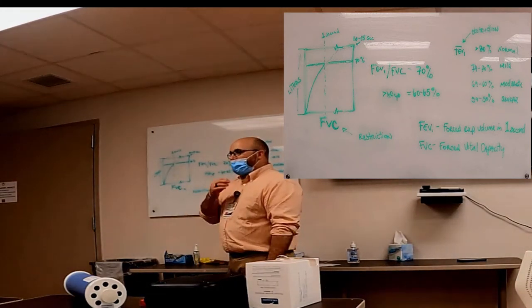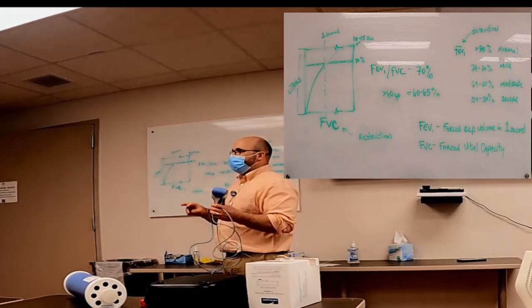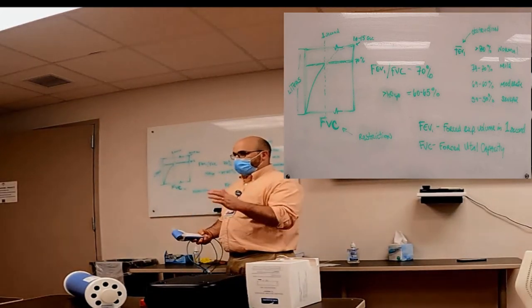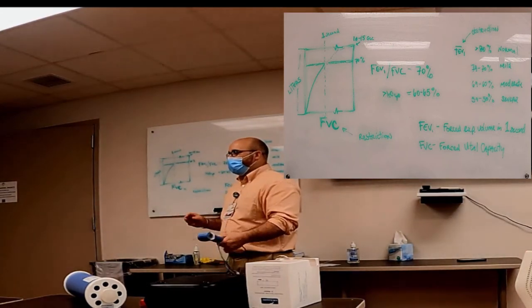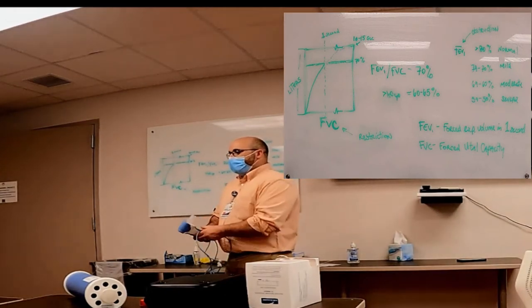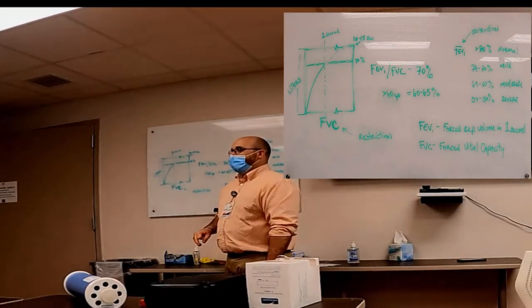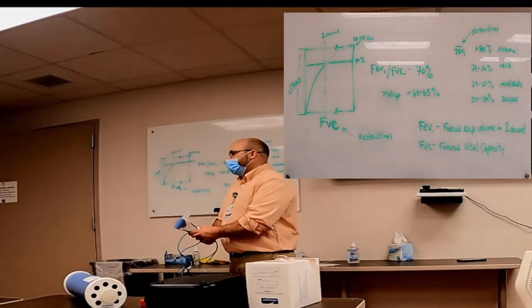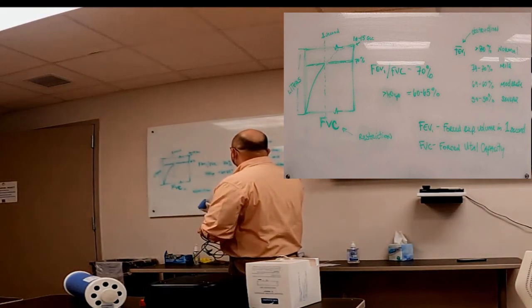That makes more sense. Yeah, so when you say PFT, a lot of people call it a full PFT, but it takes a long time, and there's a lot of special breathing, and I'll show you on the machine downstairs. There's a lot of kind of funky stuff you do with it, and you've got to know when to press the button and when not to. This is very easy. This is just a forced vital capacity. You just have to know how to tell a patient to do that. And that's the coaching that you have to do. And I think that is probably it.